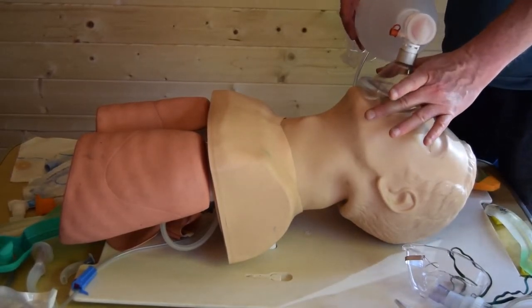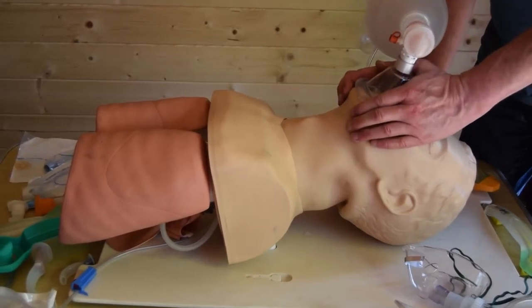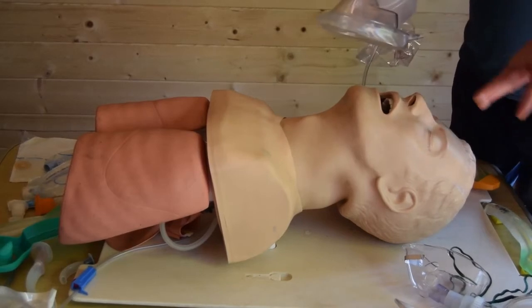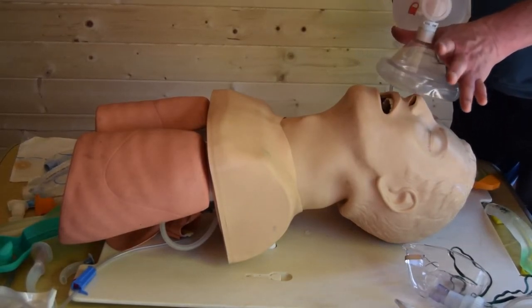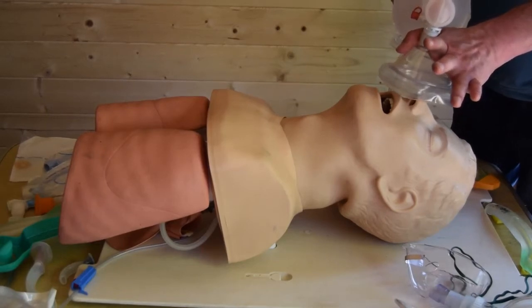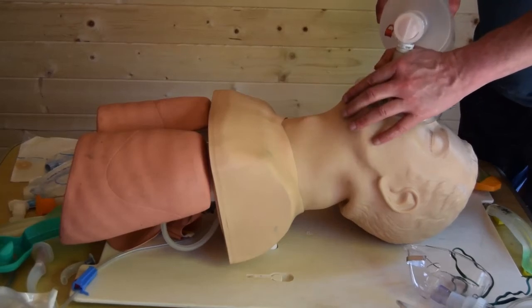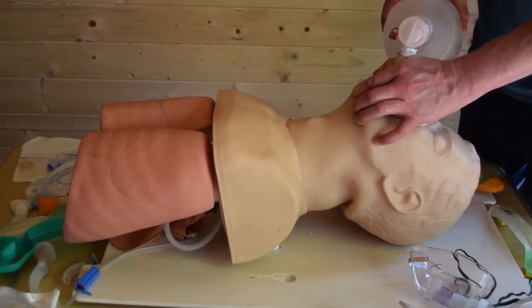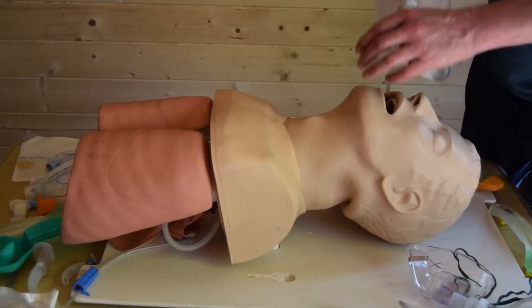This is now recommended as a 2-person technique. So one person would hold the mask in situ and the other person would squeeze the bag. However, anaesthetists use something called the anaesthetist grip or the C grip, where they place their hand around the neck of the bag valve and mask and curl their fingers round supporting the head, and it is possible to ventilate the patient this way, although it is not a gold standard technique. As you can see, it works okay.